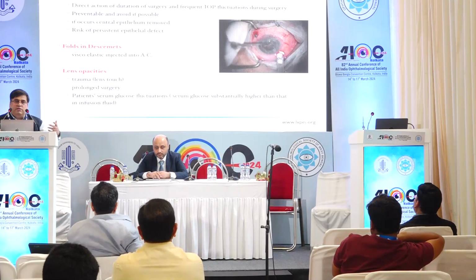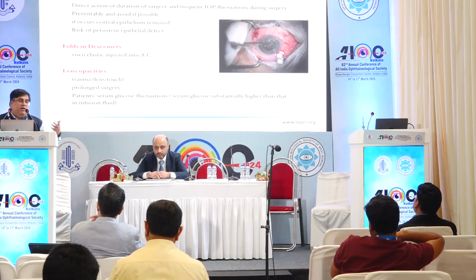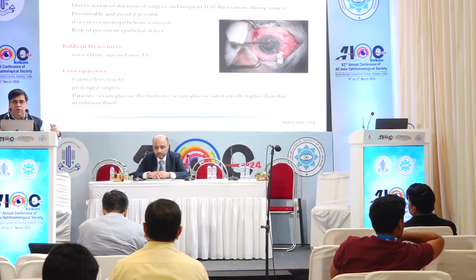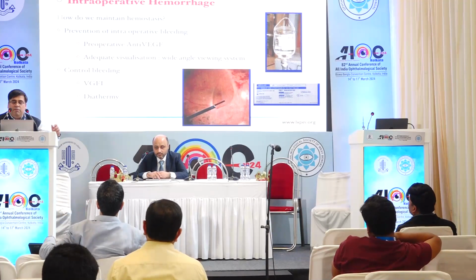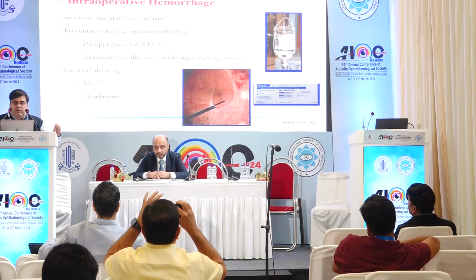But if it is too big, sometimes I've shifted to a cataract, completed the cataract, put in an IOL, and then gone ahead. So those things happen quite often in any vitrectomy, and more often in diabetics. The important intraoperative complication we tackle often is intraoperative hemorrhage.